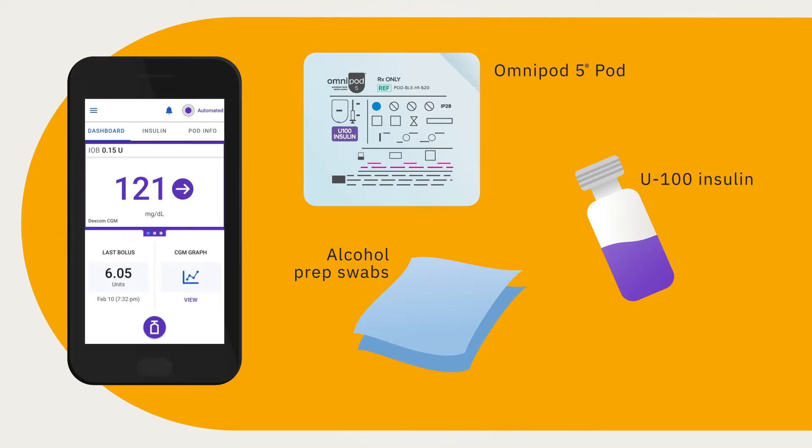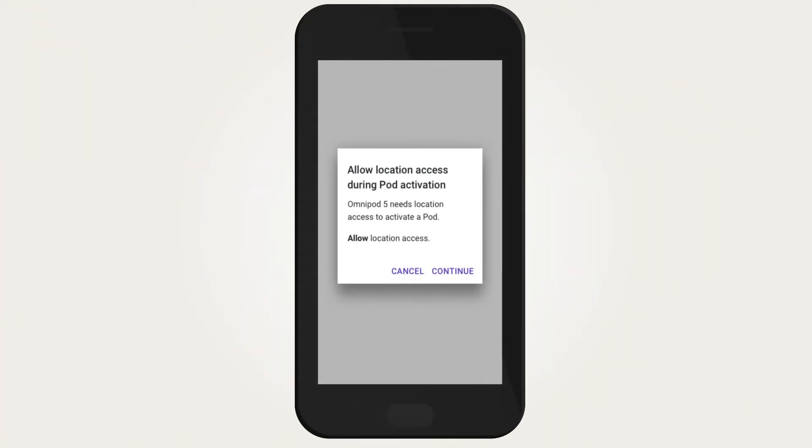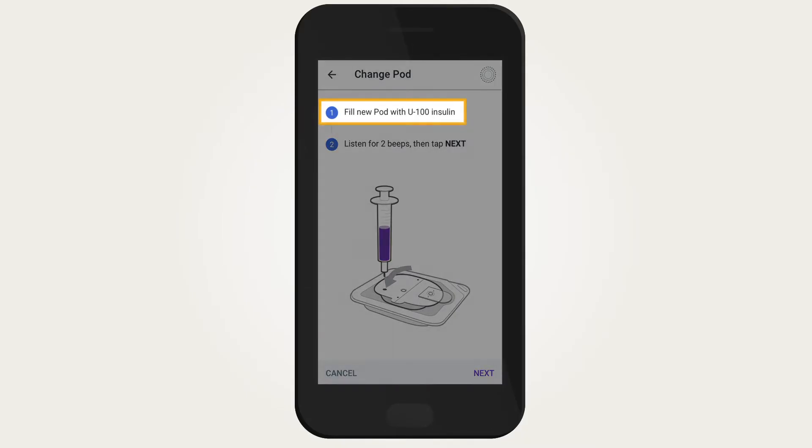If you are using the Omnipod app on your own compatible smartphone, you must allow location permission before you can activate a pod. The Omnipod 5 app needs your device's location to find and pair with a new pod. The Omnipod 5 app will provide step-by-step instructions on how to fill and activate a pod.